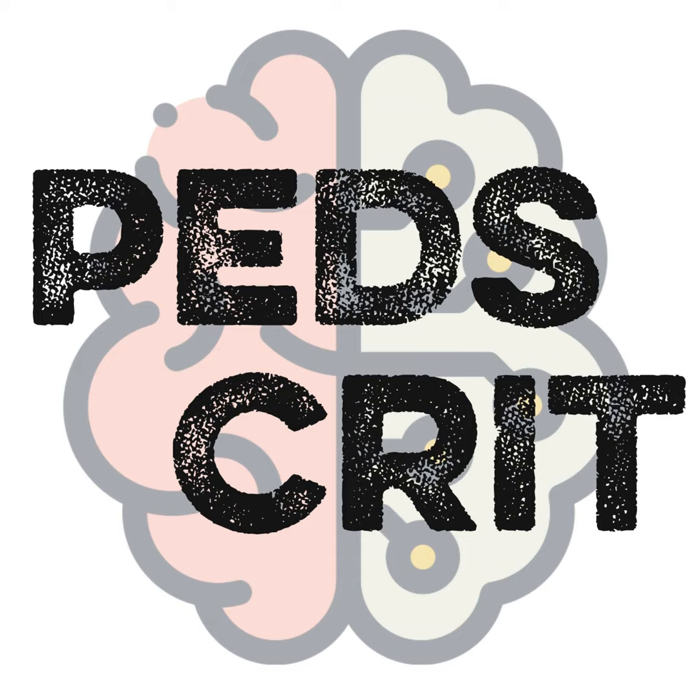And that just gets worsened by obesity or by a kyphoscoliosis, right? So if you have somebody who has baseline BiPAP and is on BiPAP because of their kyphoscoliosis and now they're intubated, you have to be somewhat cognizant of what BiPAP settings you're going to extubate them to and try to get in that neighborhood. Okay, when you're extubating, also knowing that you're going to cut their sedation, that combination of things may be a little bit higher than what you feel comfortable with in an otherwise healthy patient, but maybe acceptable for this patient.